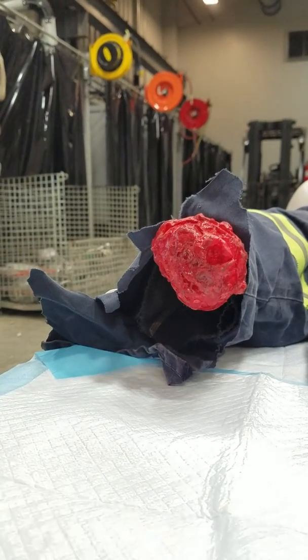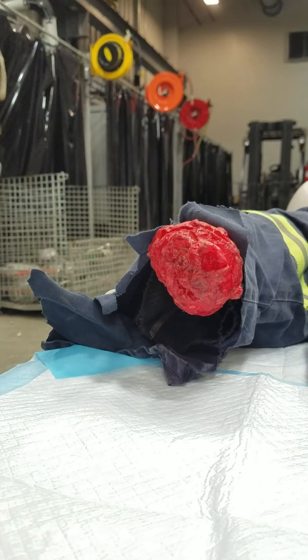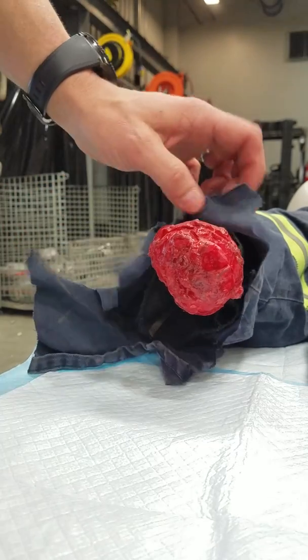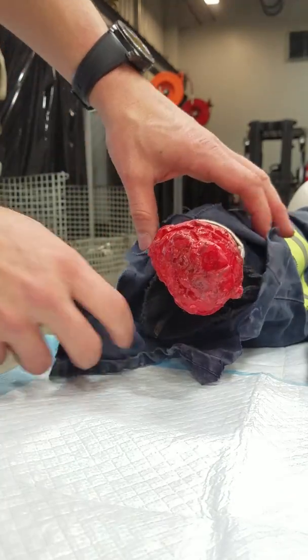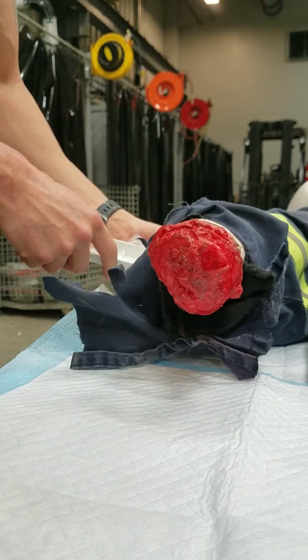Here we are. We have a right arm with a complete amputation, and we are going to simulate arterial bleeding, which will be bright red in color, pulsating out with the beat of the heart. So let's get this going. Arterial bleeding.